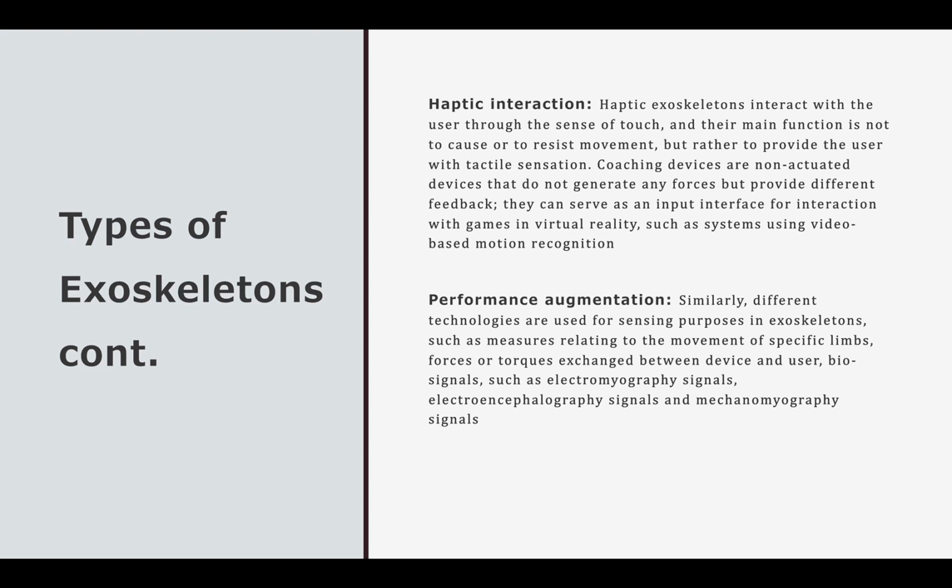Haptic interaction. Haptic exoskeletons interact with the user through the sense of touch, and their main function is not to cause or resist movement, but rather to provide the user with tactile sensation. Coaching devices are non-actuated devices that do not generate any forces but provide different feedback. They can serve as an input interface for interaction with games in virtual reality, such as systems using video-based motion recognition.